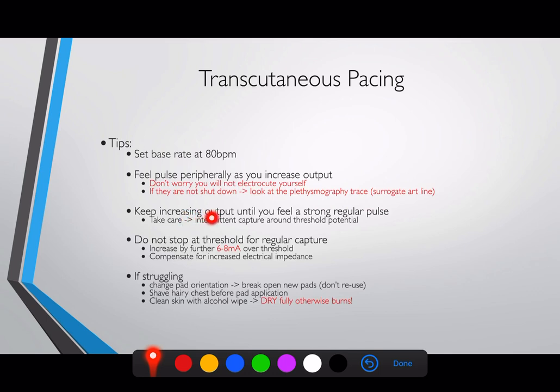Keep increasing the output until you feel a strong and regular pulse. Be careful — sometimes when you're just reaching the threshold where electricity is getting to the heart, it might not trigger a beat every time. Note the threshold where you start to get capture — where the heart rate starts jumping up to 80 beats per minute and continuously runs at 80 for at least two screens' worth or one minute.